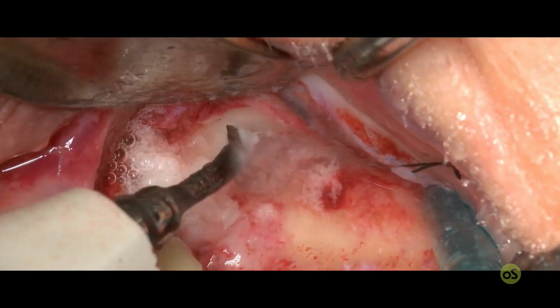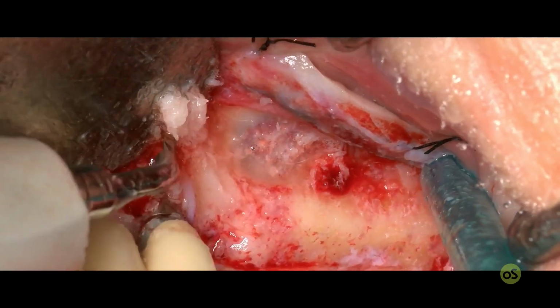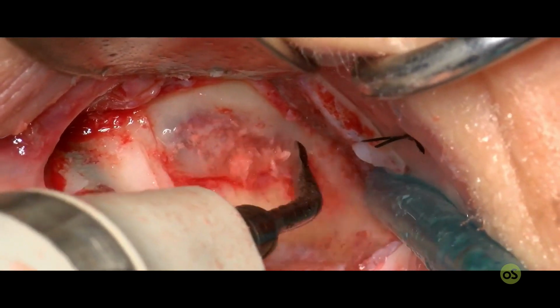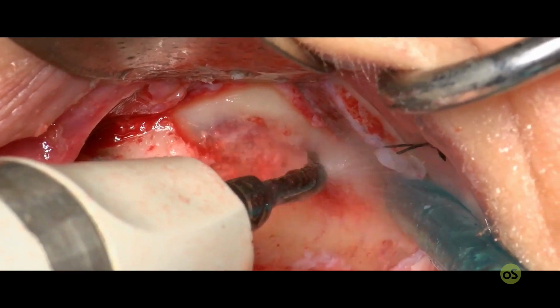I developed this technique many years ago. I introduced this technique in Boston, at the Quintessence Boston Congress in 2004, and from then until now, I have had very good results. Unfortunately not in this surgery, and now I will show you why.